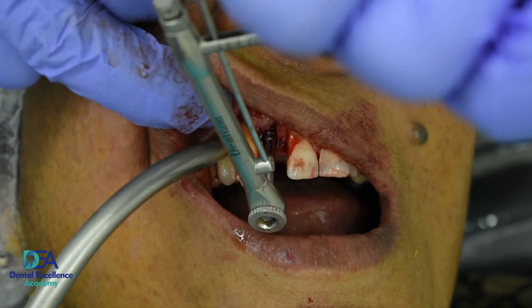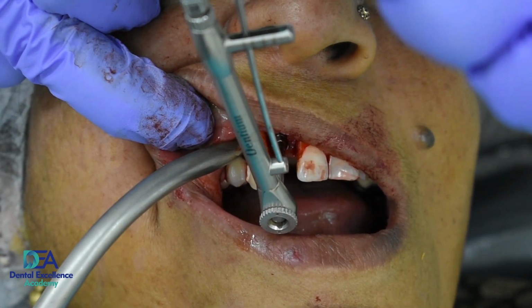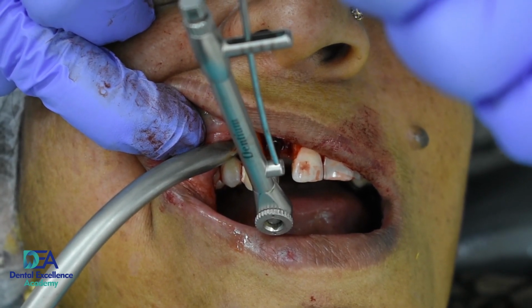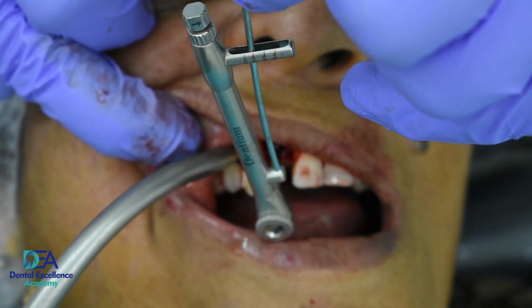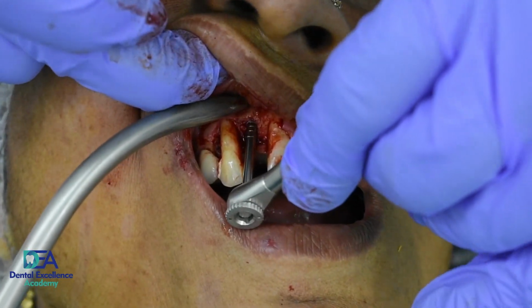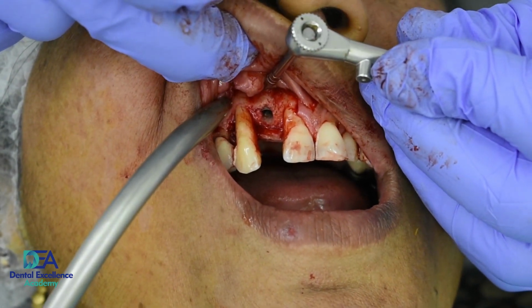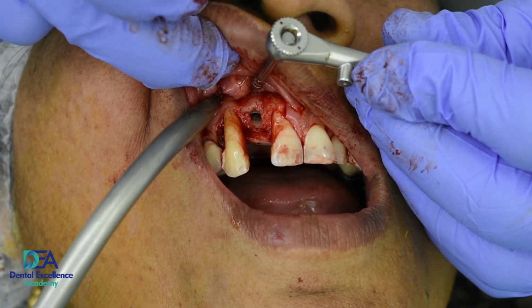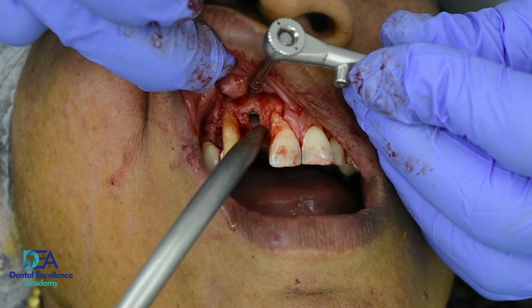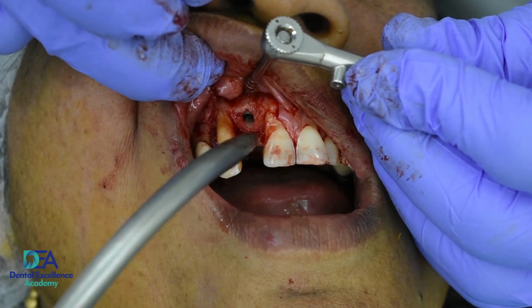So see, we are getting almost 35 to 40 Ncm of torque. Can you see we are equicrestal on the buccal aspect and subcrestal on the palatal aspect because of the bone loss on the buccal aspect.